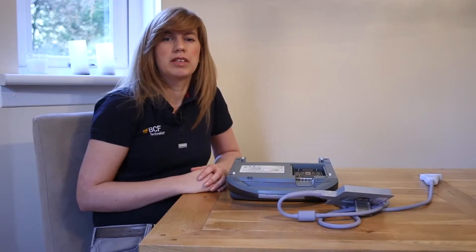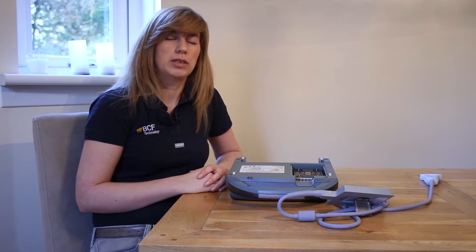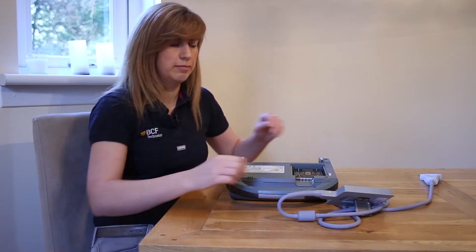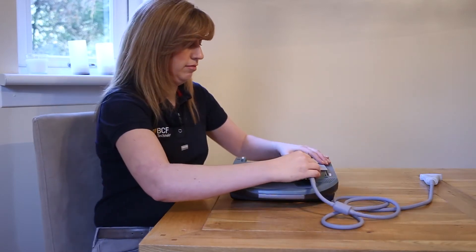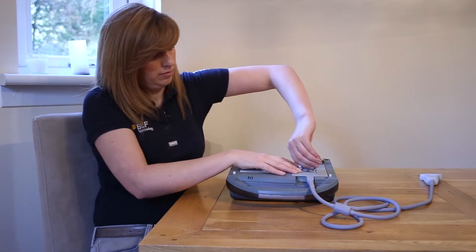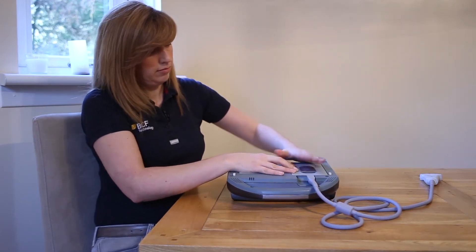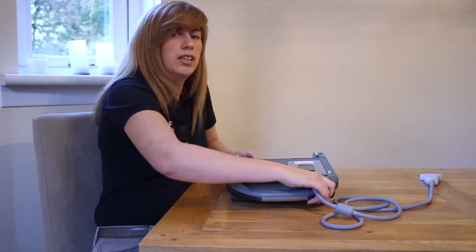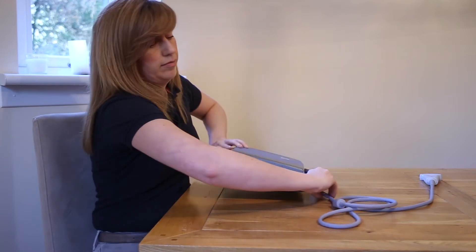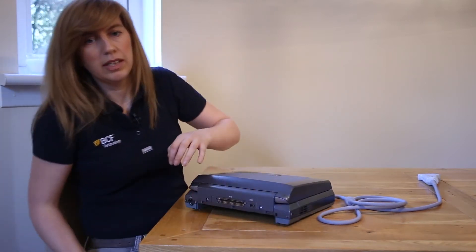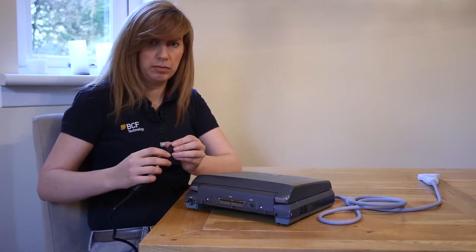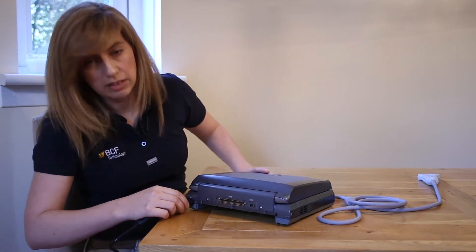To attach your probe, simply fit it to the back of the scanner and twist the metal lever to lock it in place. The power supply, if necessary, is attached to the back of the machine. However, a battery is fitted as standard and will give you up to two hours of scanning time.